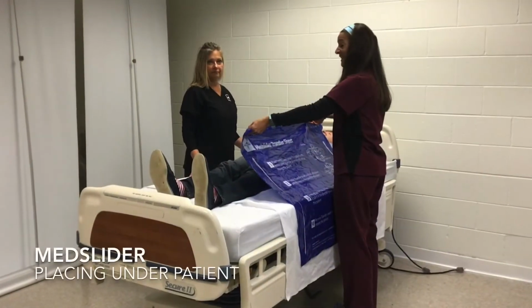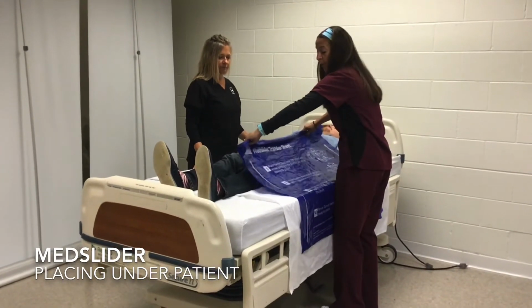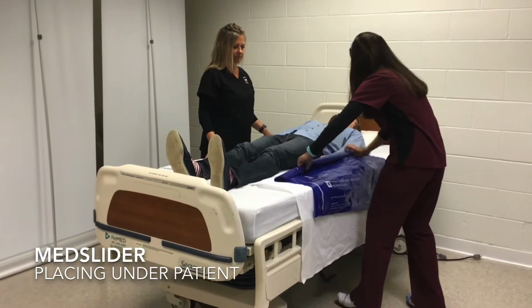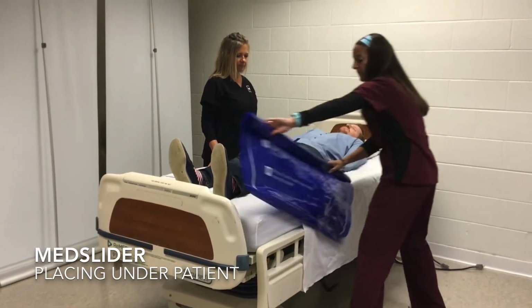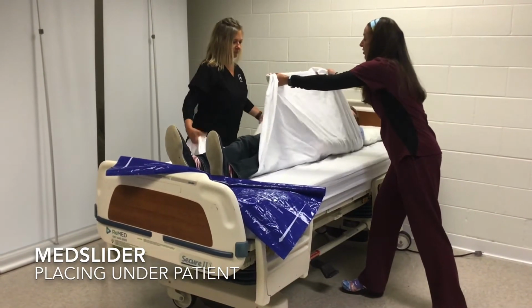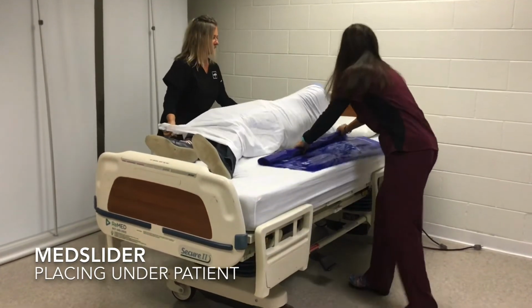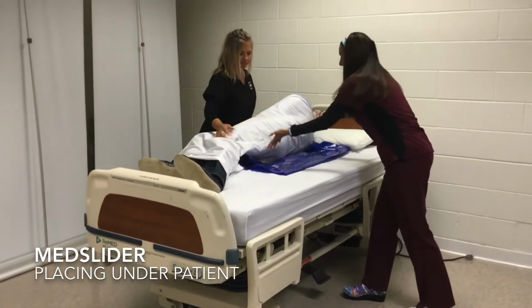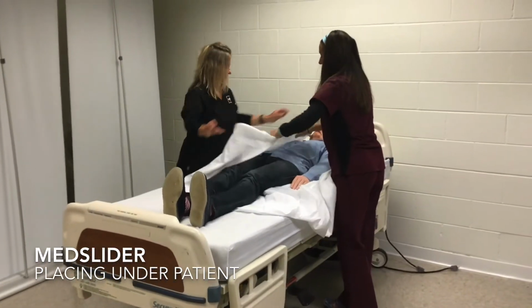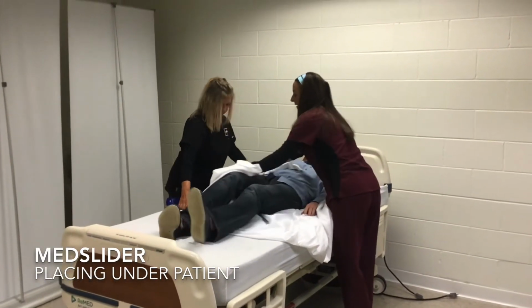In order to get the MedSlider under the patient, we're going to demonstrate a traditional log roll. So first I'm going to roll the MedSlider up a little bit so that I can slide it halfway under the patient. Next we're going to use our draw sheet and she's going to tilt the patient towards her. Slide it under. I'm dropping back. And now towards me. And then I simply just unroll. Okay. And now it's ready.